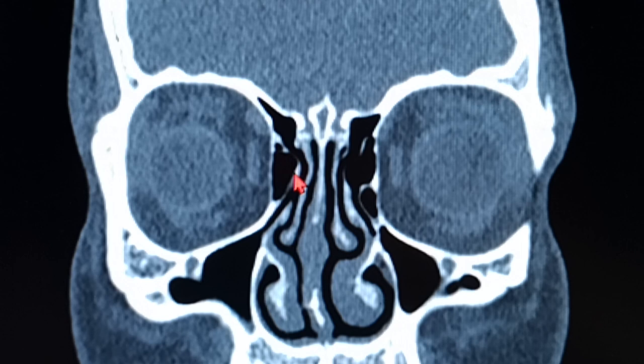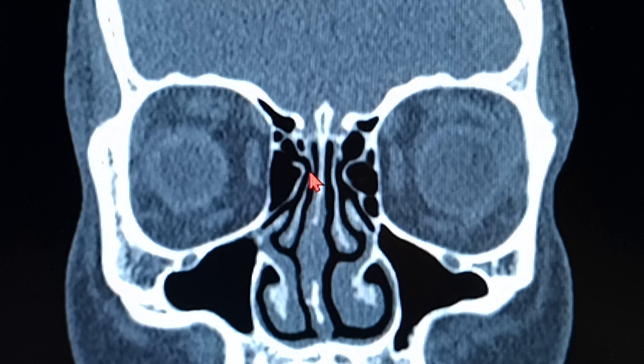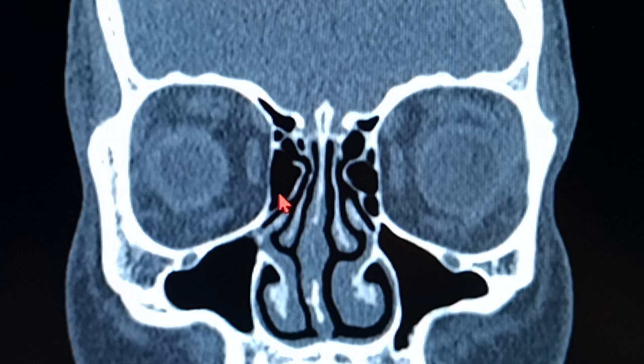That's the huge bulla ethmoidalis. If I'm still going behind, you can see the curvature of the middle turbinate. Now, behind the bulla, it will become completely horizontal. The middle turbinate will turn behind the bulla as completely horizontal and will go on the lateral aspect and attach itself on the lamina papyracea right here. That's the lamina, we all know. So this is still the bulla ethmoidalis, the large cell you can see over here. This on the left side is bulla ethmoidalis.